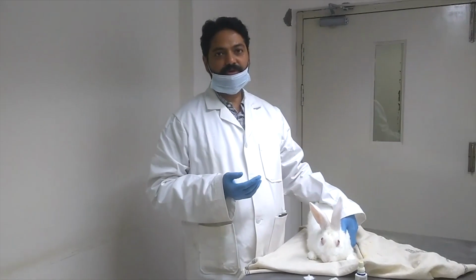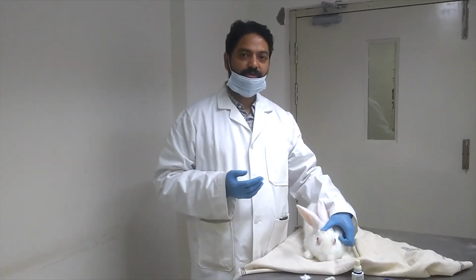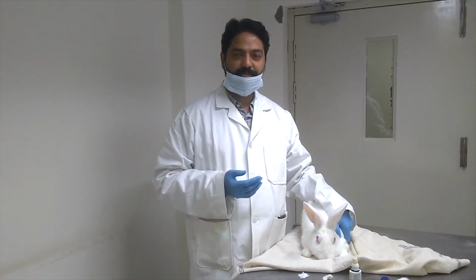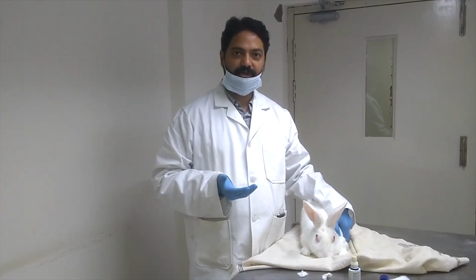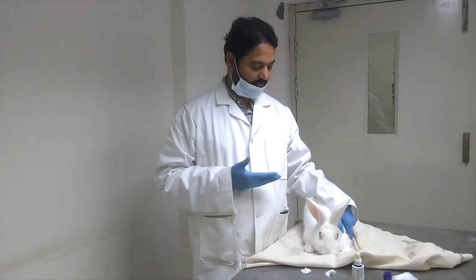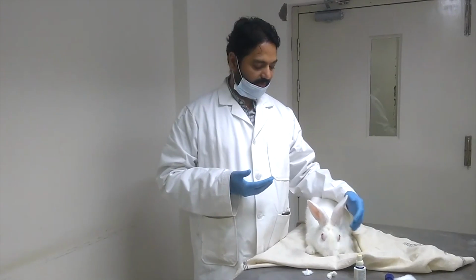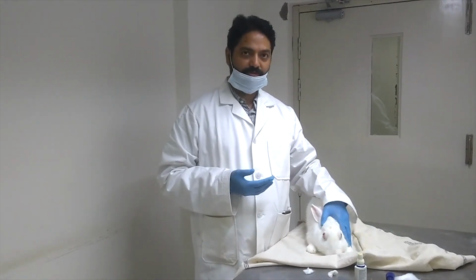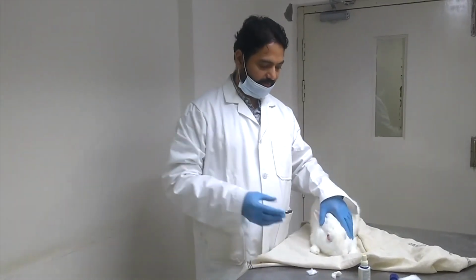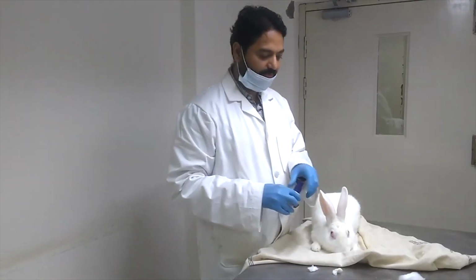And this is actually very important when you handle animals: whatever procedure you go through with the animal should be ensured not to have pain. If the procedure is painful, you understand it is a painful procedure, you anesthetize it. Since this procedure is not painful, it is not necessary. So this is a very important step to ensure that the animal has no pain. It should be relaxed.